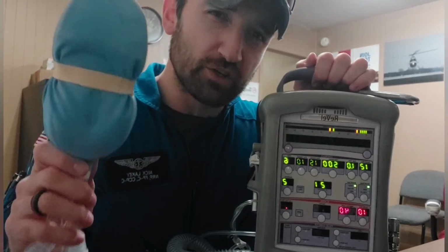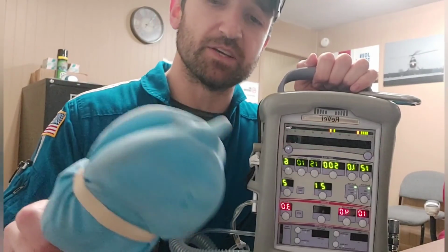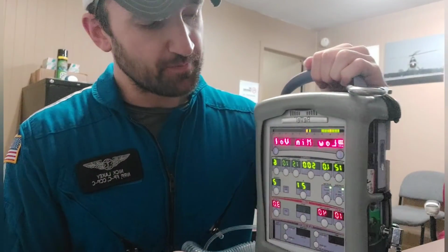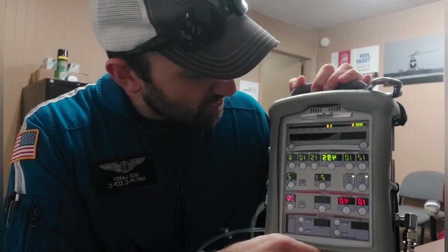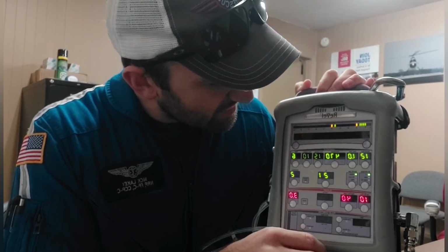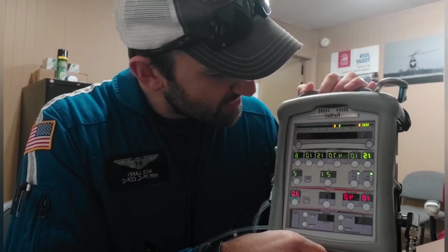So it's important that we don't hook this up directly to the patient right away. And the reason for that is because I don't want to start ventilating the patient with whatever's stored within this ventilator. So I'm going to get my settings correct here. And so we decided that our tidal volume was going to be 470. So I go up here and click where the tidal volume is, and we'll go down to 470. I'll select that. And then we're going to take the rate up to 17.